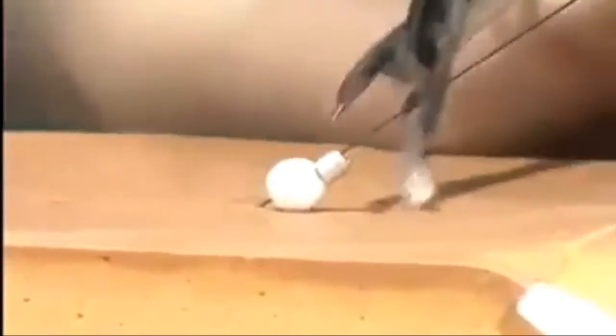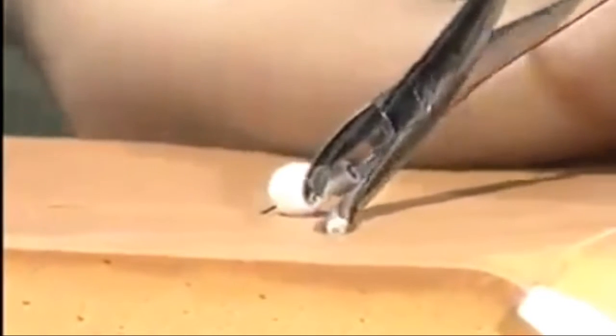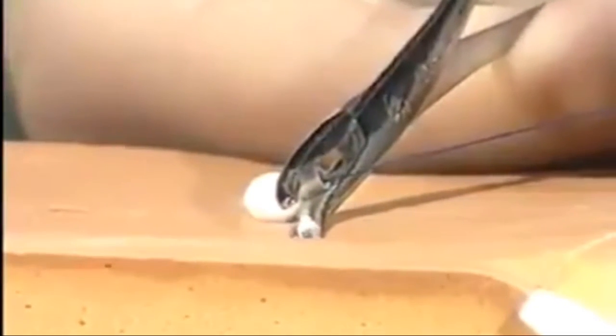Once the closure has been completed, a further bead and cuff are placed onto the suture end and once the correct tension has been applied to the suture material, the metal bead is crushed using a substantial hemostat or bead crusher.